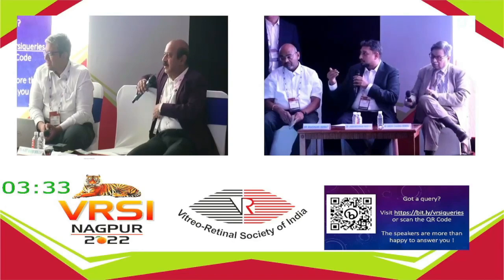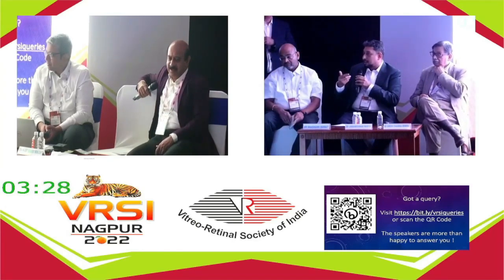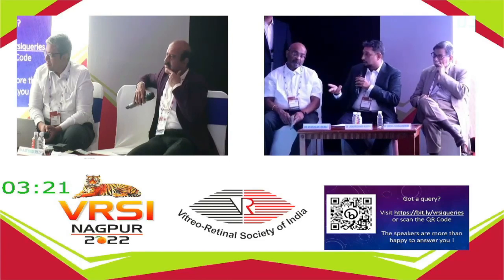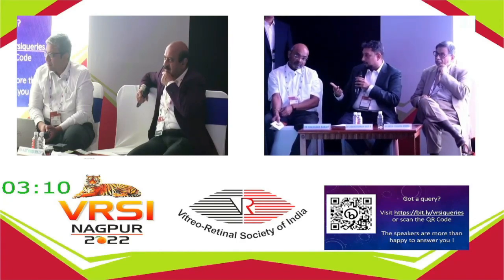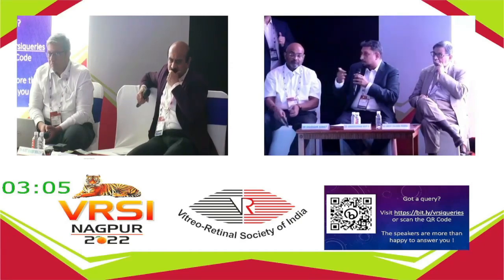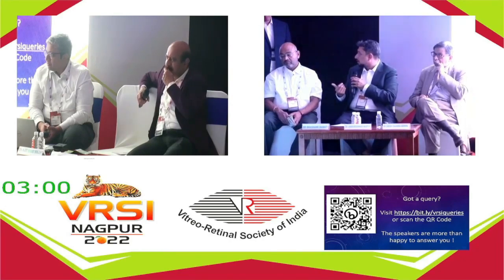So just to make a point, the multicolor of this Spectralis gives you benefits from the topographic and elevation data, while in true color you get more realistic tissue information. The multicolor, however, has a problem of obscuring and masking certain RPE pigmentations, and you can totally miss a nevus sometimes with multicolor, which you would pick up on clinical examination. So these are some of the disadvantages of multicolor. That is, sometimes you miss deeper lesions.